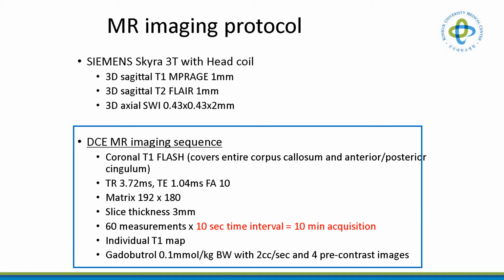We used the following MRI imaging protocol and used an acquisition time of 10 minutes in our study. In other studies, it was recommended to use an acquisition duration of 15 minutes or longer. But considering the lower contrast to noise ratio with longer acquisition duration and compliance of participants, we believe a relatively shorter acquisition duration is more suitable in our study.